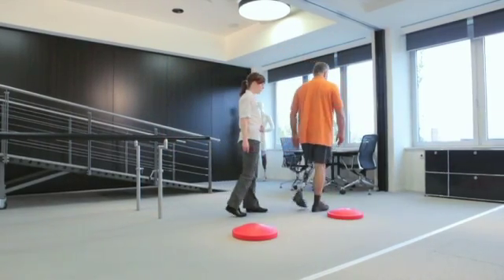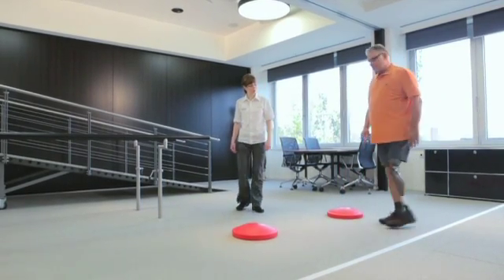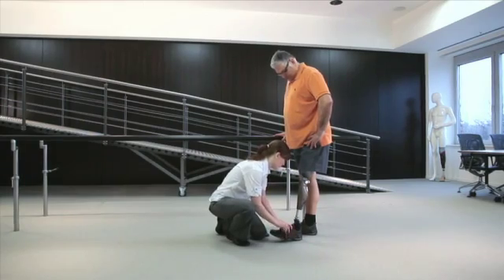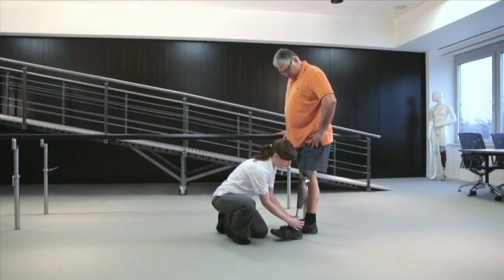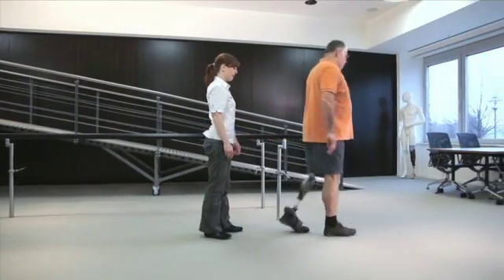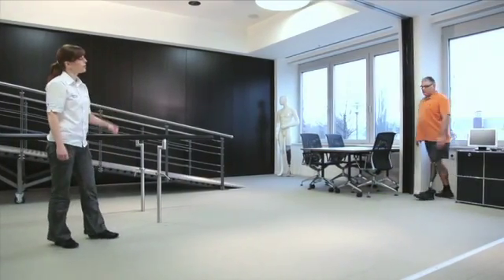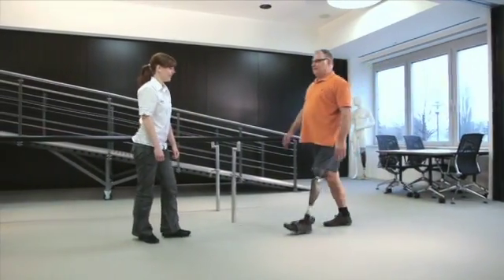Please note that the knee will instantaneously adapt to changes in shoe weight that are applied to the prosthesis. You can demonstrate this by adding extra weight to the foot. Help the user get a sense of how the knee behaves during normal walking. Put an extra weight around the foot. Have the user take a few steps, then remove the extra weight. Let the user walk again for several steps. The swing characteristics of the knee will stay the same during this exercise.